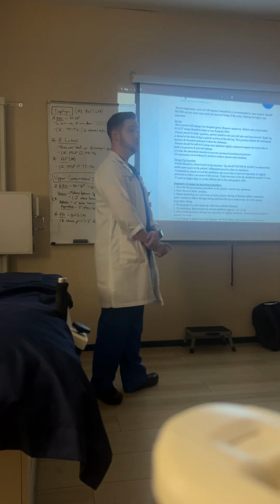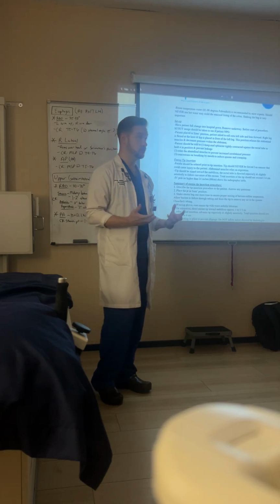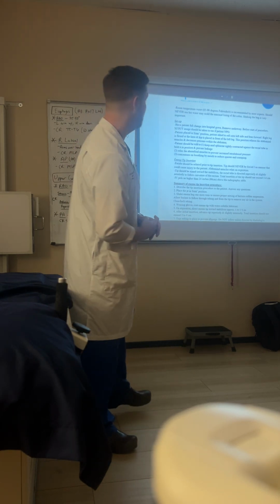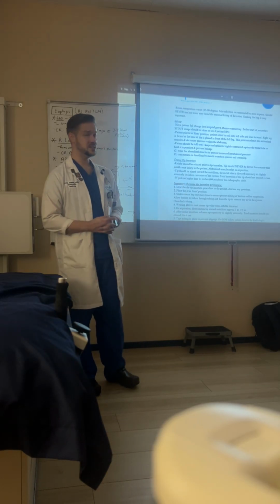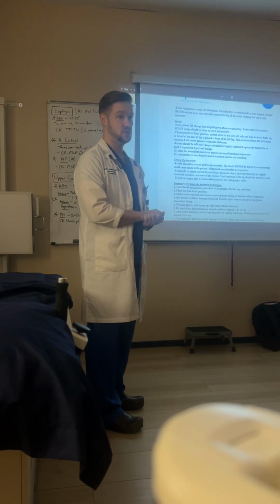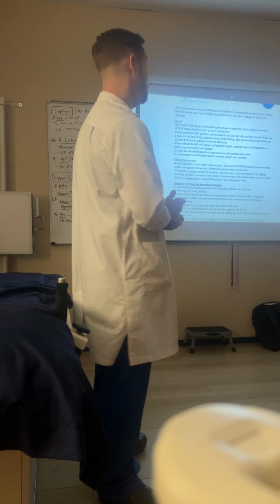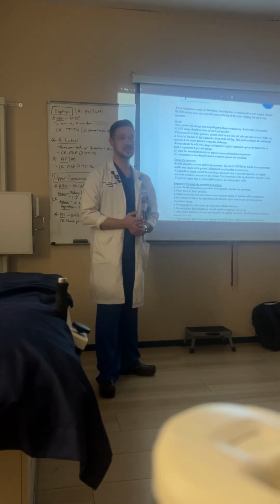If you use cold water, it can cause a lot of spasming and it's very uncomfortable for the patient. So set up, we're going to have the patient change into a hospital gown. Take off absolutely everything. Remove their underwear before the start of the procedure. We're going to take a scout abdomen x-ray to see if the patient followed the prep instructions. So we're going to do a KUB of their abdomen to see if they have retained any what? Poo-poo! Exactly.